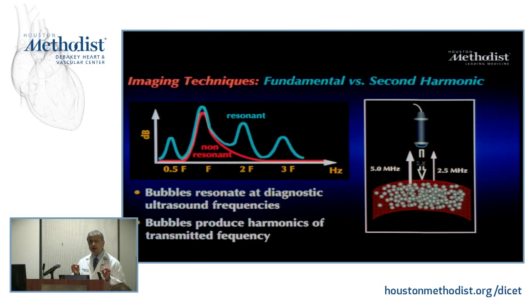And we knew that contrast, these tiny little microbubbles that resonate whenever you hit them with ultrasound, hit them with fundamental, they emit harmonics. Okay, and we said, well, for you to best see them, you have to image at harmonic, right? So if I'm sending at 2 megahertz, I would listen at 4 instead of 2 megahertz and get this strong signal from this.